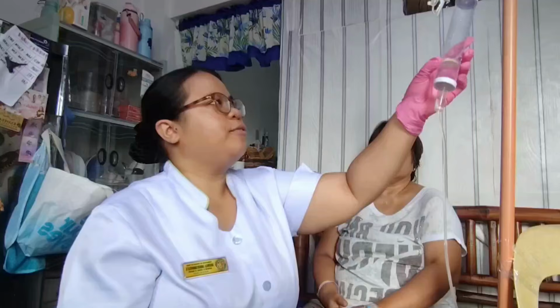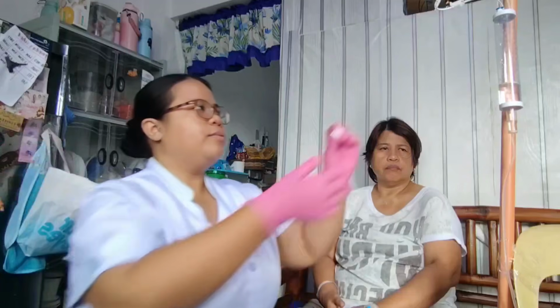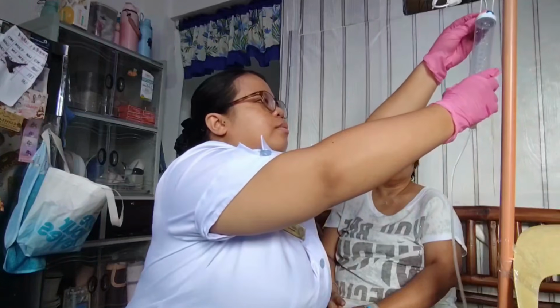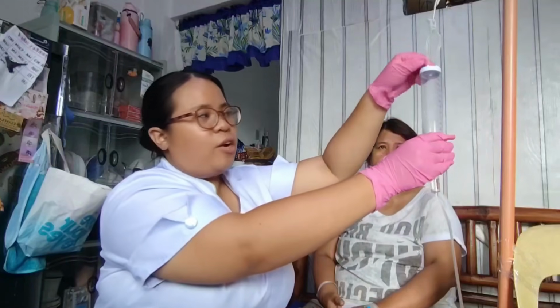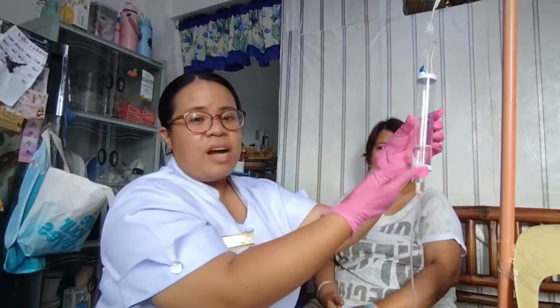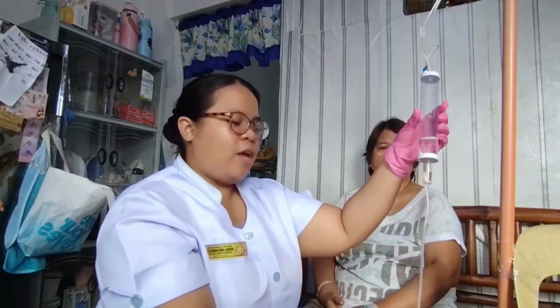So make sure that we're going to hang this. Okay, and after that we will now incorporate our medication. So first is to disinfect the medication port with alcohol. Okay, then dispose. Then after that, make sure that the air vents are open. So here, the air vents are open, as well as the floating valves are floating, to ensure that there's a smooth flow of the IV fluid.